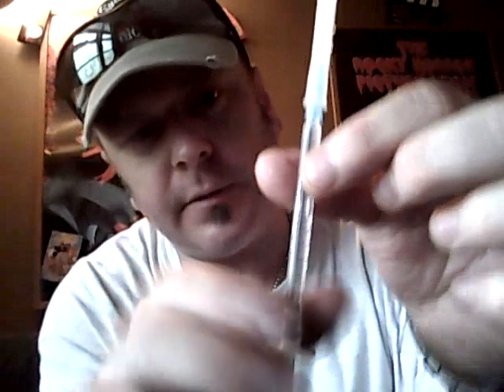You can't really see them here. Well, maybe a little bit. Yeah. I have one right in the middle. I have one at the bottom here. I have a tendency to think that this other person who posted a video was right: you flick it and you flick it and you flick it. I tend to hit it wherever the air bubble is, and that seems to help, and then move your other hand around so you can get the air bubbles up to the top near the injection needle. And that's not too bad. I lost a little bit of product in there somewhere.